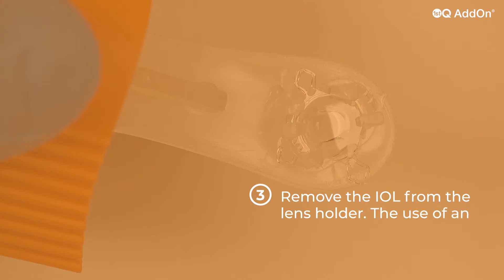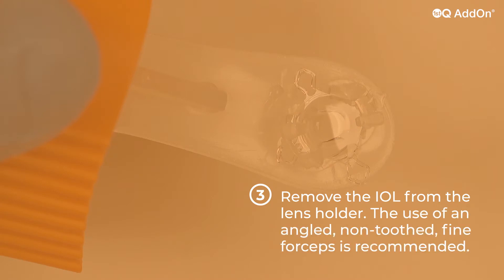Remove the IOL from the lens holder. The use of an angled, non-toothed, fine forceps is recommended.